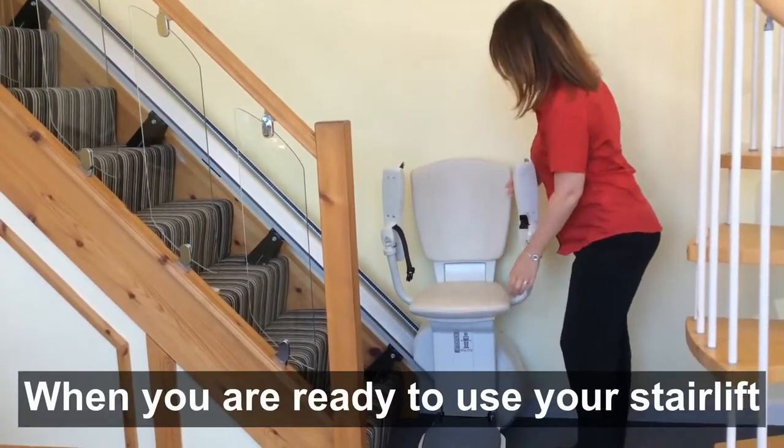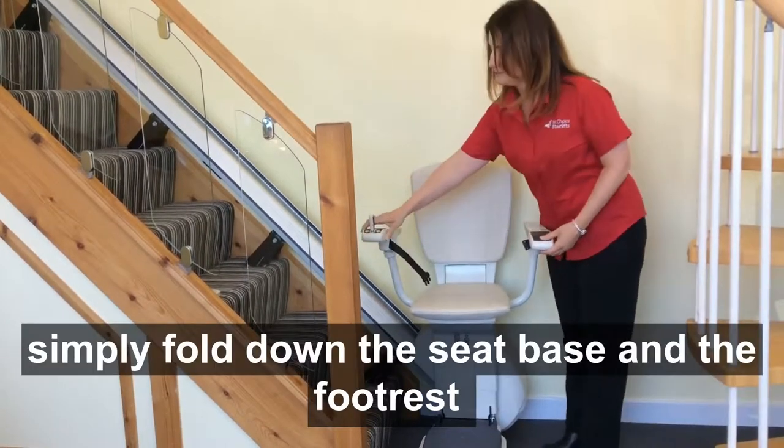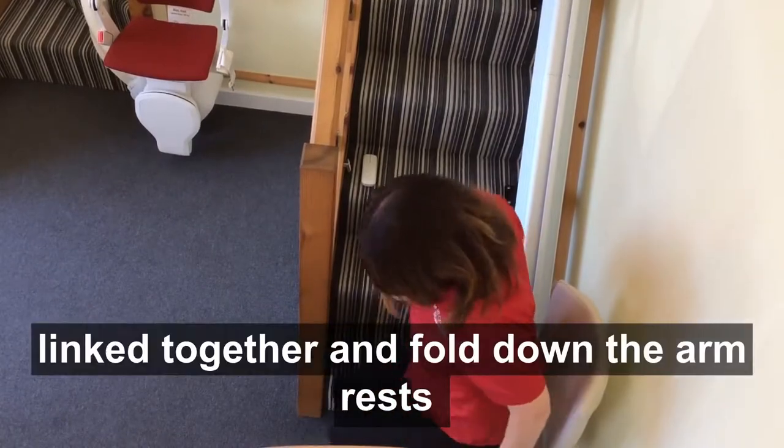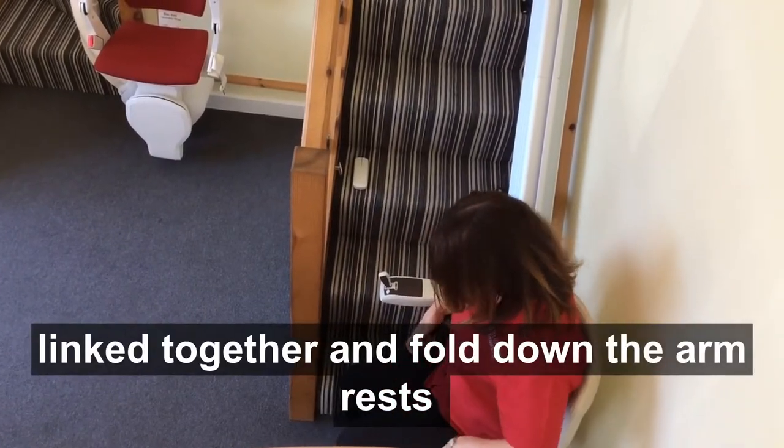When you are ready to use your stairlift, simply fold down the seat base and the footrest, which in this particular model are linked together and fold down, then fold down the armrests.